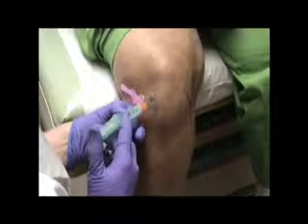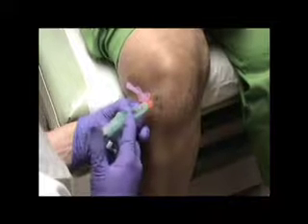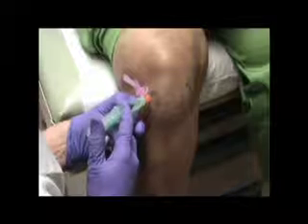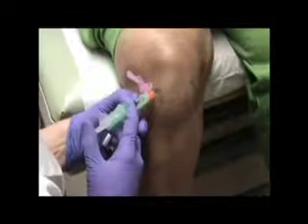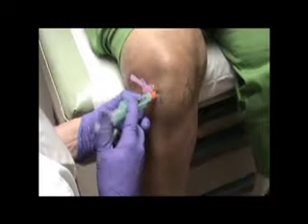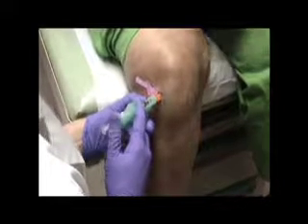If there is no blood return, the anesthetic agent can be safely injected by pressing the injection plunger. While alternatively aspirating and injecting, the finger positions do not change. Only the thumb moves from plunger to plunger, permitting precise needle control, less patient pain, and greater patient safety.